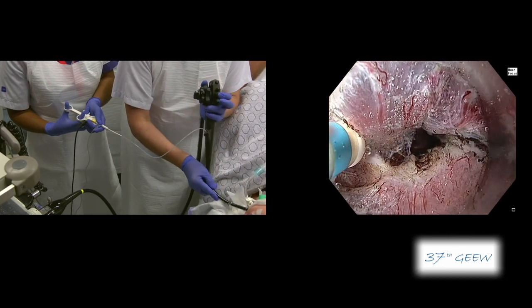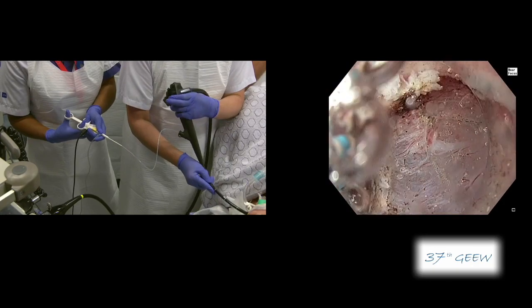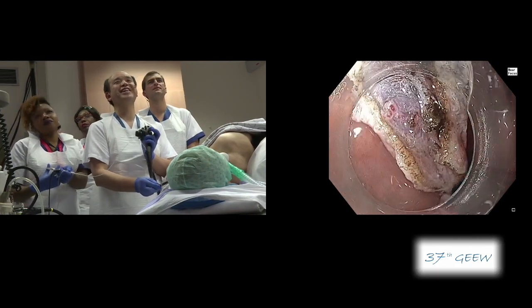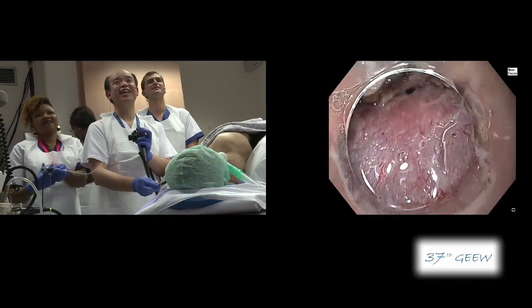Fortunately, this is almost the end of the procedure. There were no significant blood vessels at all, so it is a relatively simple procedure. I think it is already finished. Excellent — really nice work.